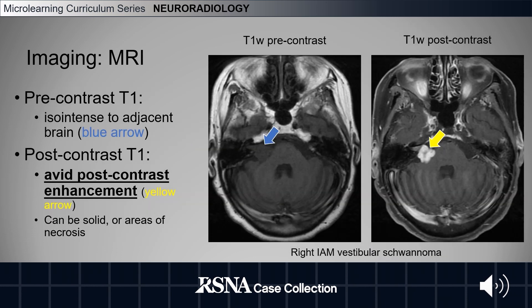Additional MRI findings include post-contrast enhancement. In our pre-contrast T1-weighted images, we see a neoplasm that is iso-intense to adjacent brain as shown by the blue arrow. In our post-contrast T1-weighted images, we see avid post-contrast enhancement as shown by the yellow arrow.